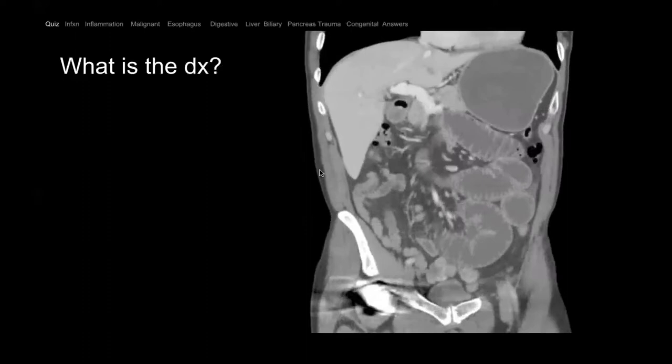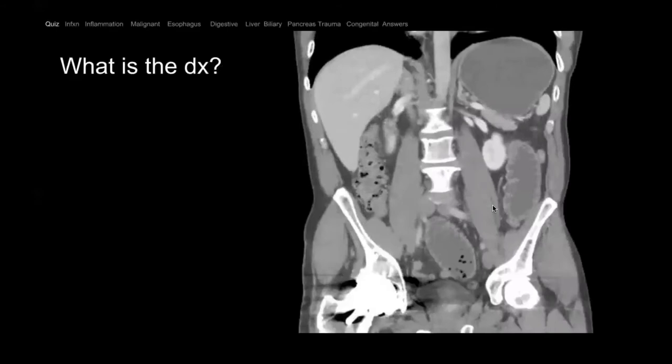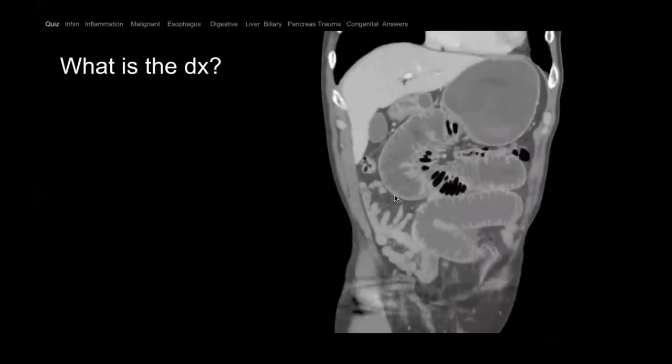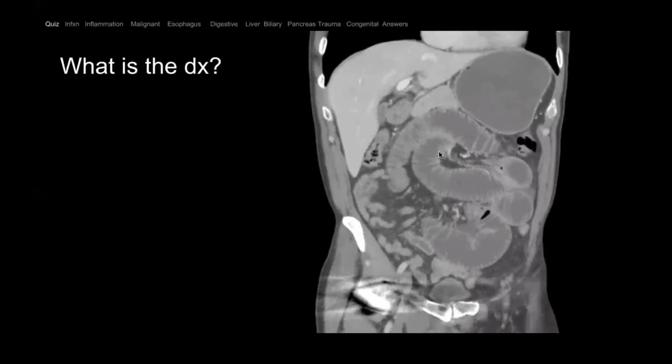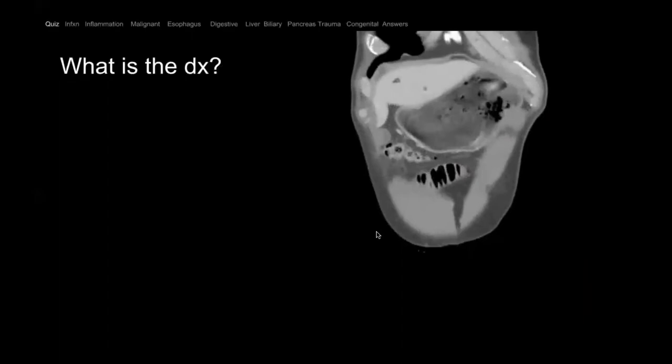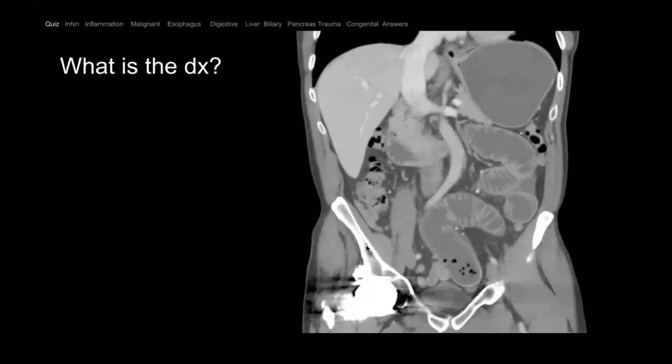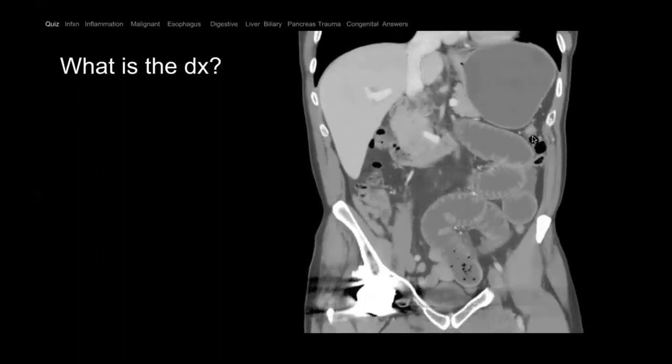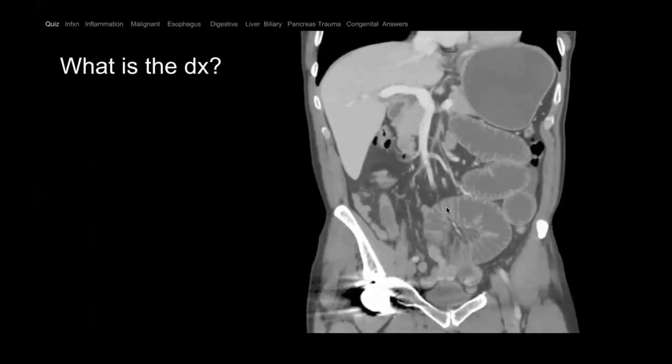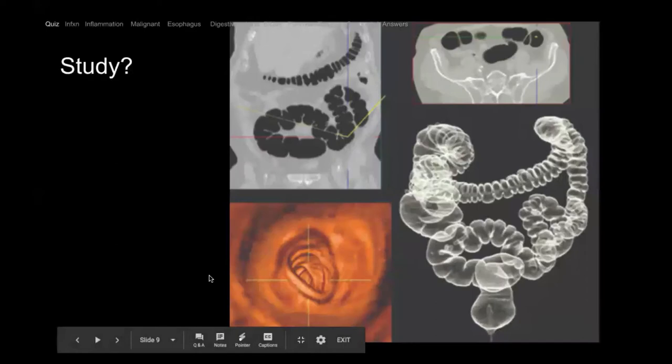What is the diagnosis here? Patient comes in with abdominal pain, nausea and vomiting. This is a CT scan and you see that some of the bowel is really dilated and some is completely decompressed. The guesses so far have been regarding colon. The colon is a picture frame — ascending on the right, transverse across the top, descending on the left. But this is more central, and in the center of the abdomen lives the small bowel. So this is more of a small bowel process.